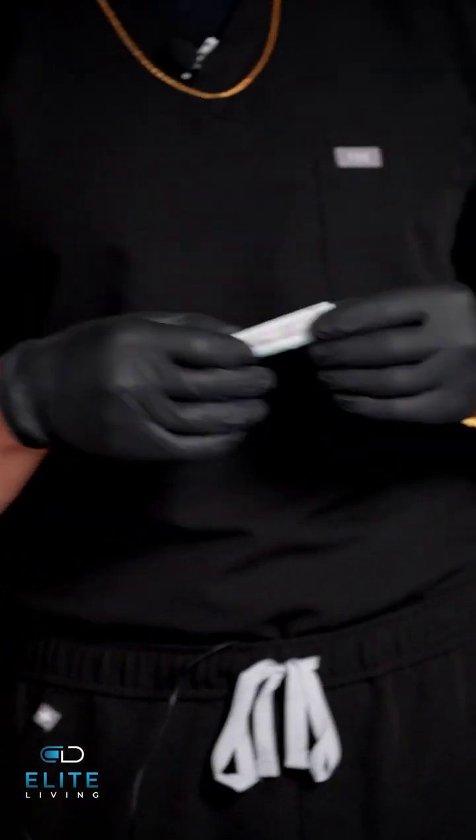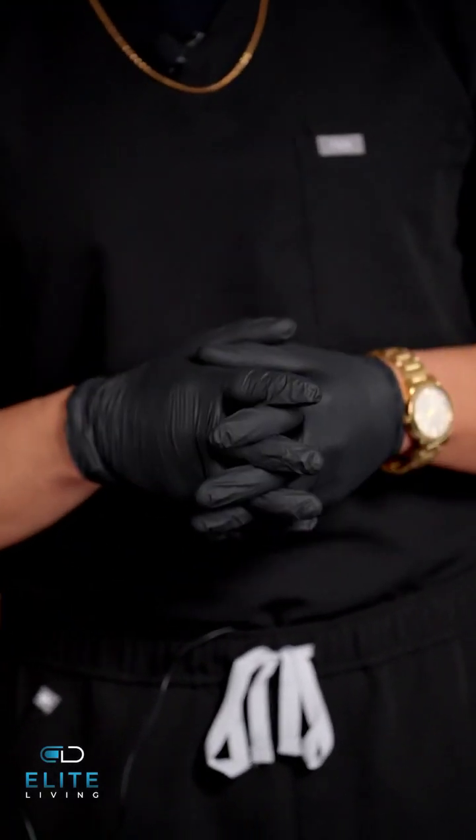Once that is done, we'll take that off, and then we'll put on the 25 gauge needle back on the syringe. This is the needle that we will be using to inject the muscle, and today we will be injecting it in the glute. And most importantly, always have gloves on as well for sanitary precautions.